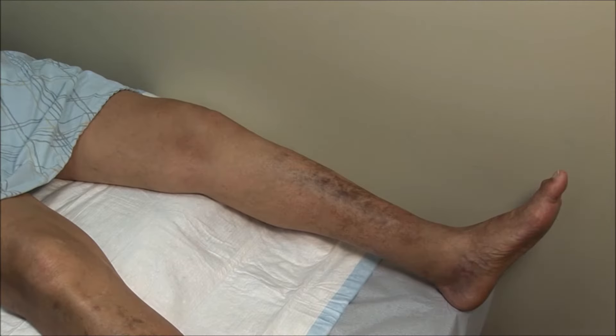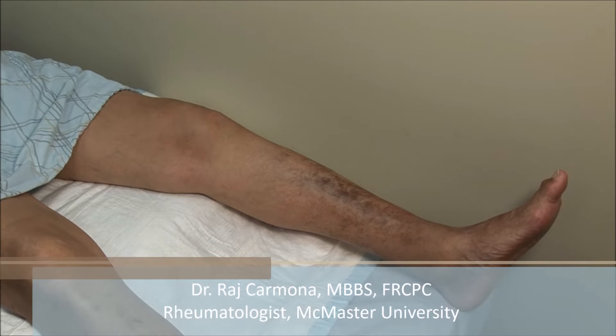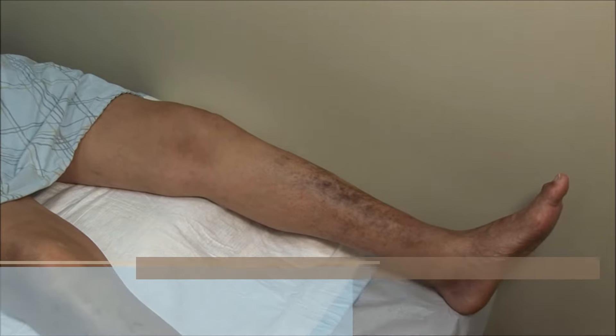This patient has rheumatoid arthritis with a large knee effusion. For the medial approach to the knee joint, the patient is lying supine with the knee extended.